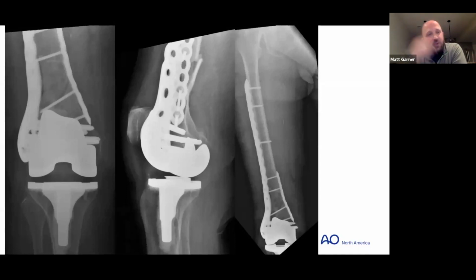And then I use flexible reamers to ream up in the distal block. But I think this is perfect, and for me, final fixation would really depend on the CAT scan and what I had to look at. But in an 80-plus-year-old, I'd try to not only get intramedullary fixation, but I'd try to put my distal interlocking screws right up against the implant.